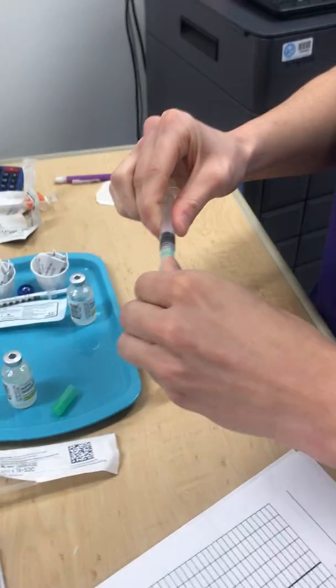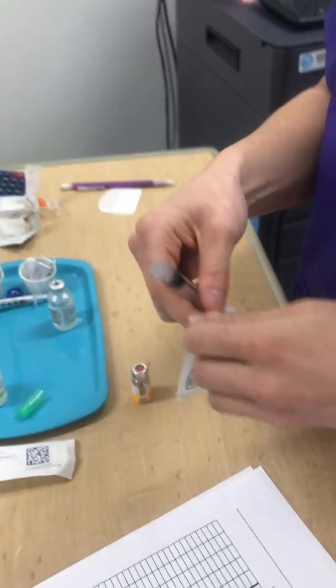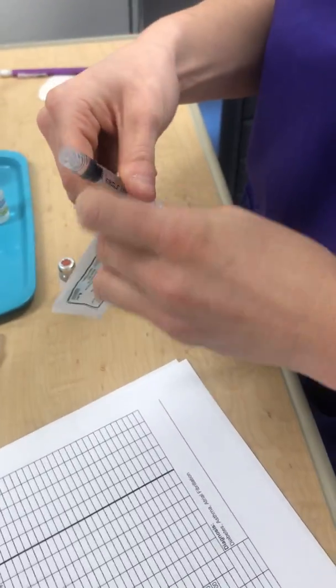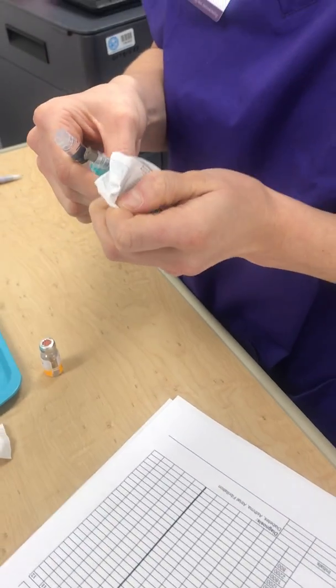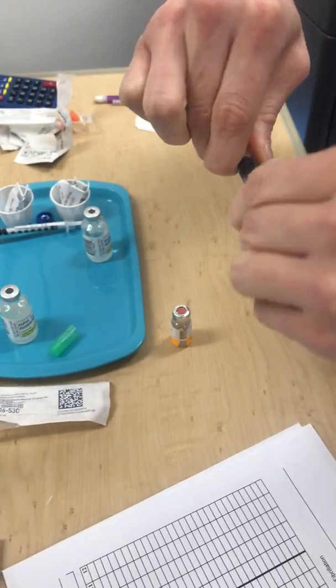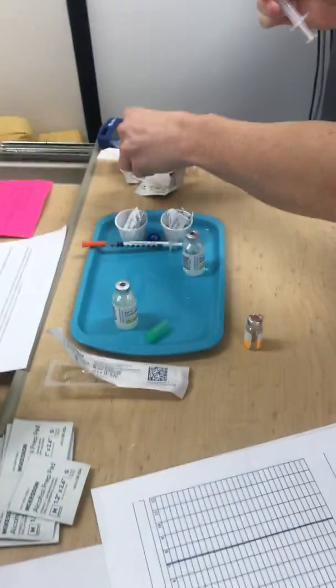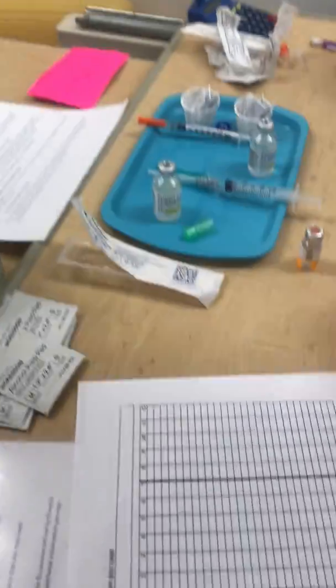Okay. Then I'm going to open my other one. And then put that straight on. Okay. Yep, it's still at the correct amount that I need. And I'm going to make a label for it just right away.